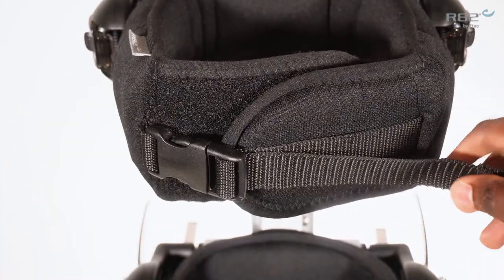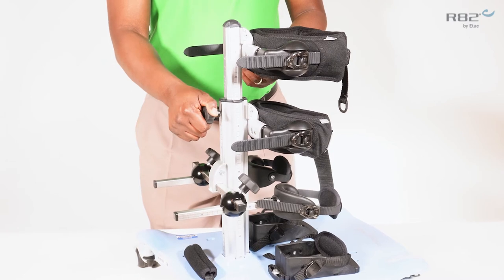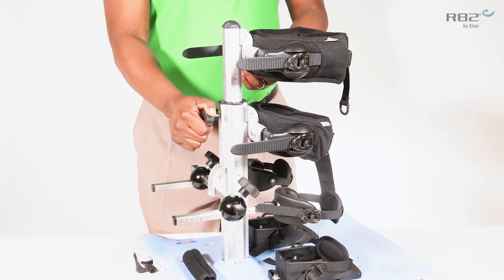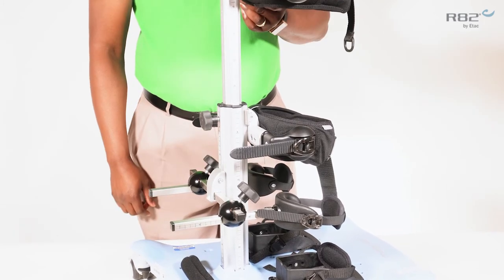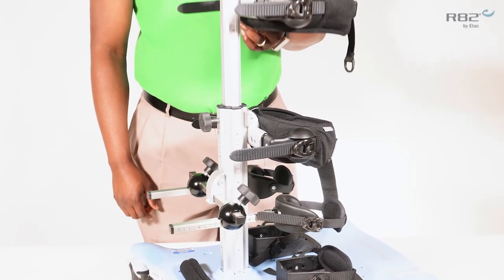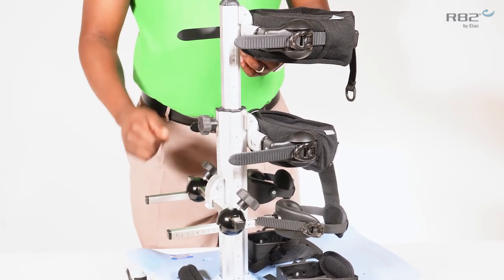To adjust the height of the trunk support, simply loosen the knob located in the rear of the height adjustable column. Adjust your trunk support to the desired range and tighten the knob.